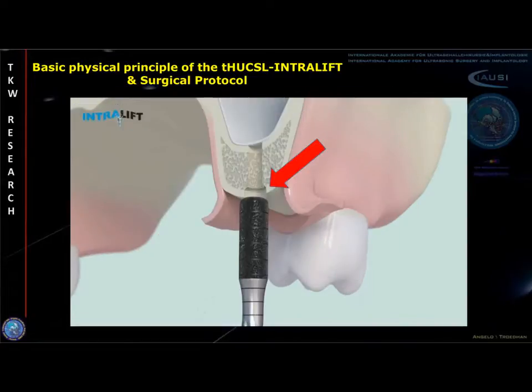After opening the subantral bony sinus floor with the third flat diamond-coated piezotone tip, a shallow receptacle is prepared for the final cavitational ultrasonic tip, enabling the hydrodynamic detachment of the sinus membrane.